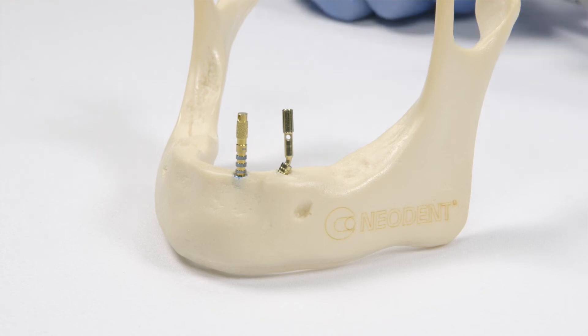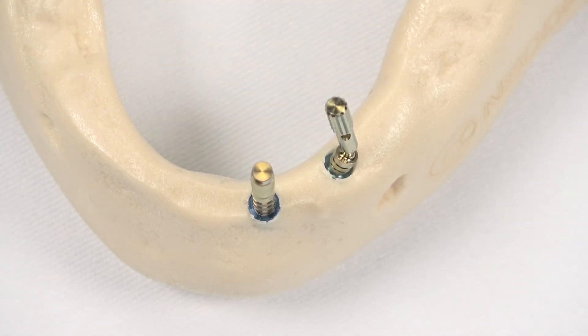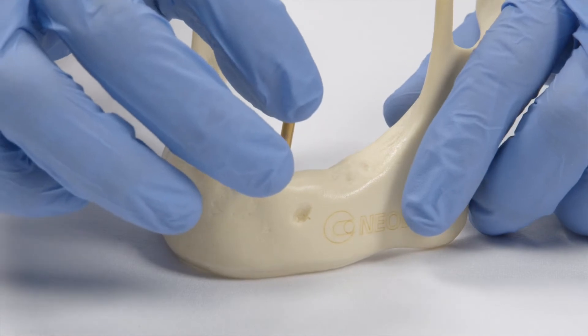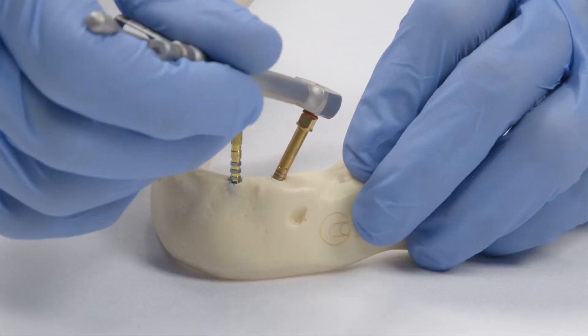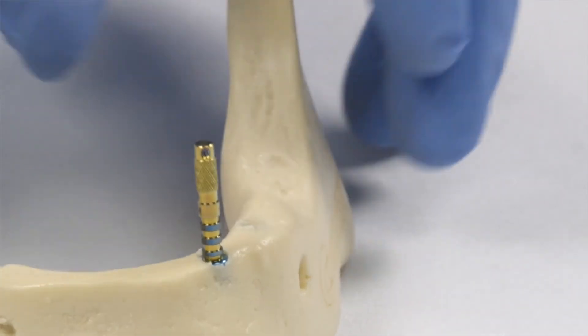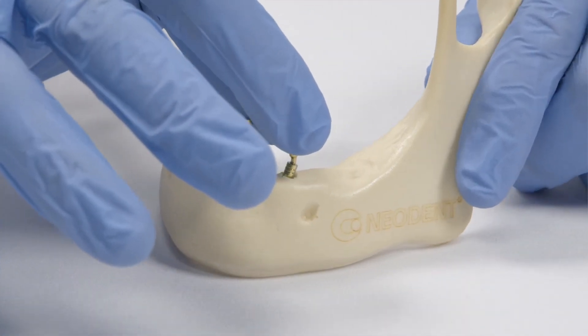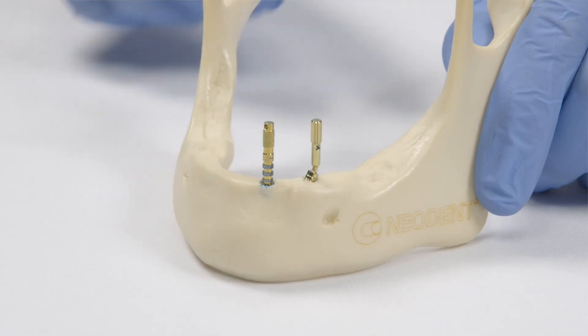When changing the position to another hex position, understand that they may be parallel from the front, but from the top the abutment isn't right. So the only way to fix that and have something in between is to re-engage the implant driver and with the torque wrench rotate that implant more forward. The goal now is to have the try-in abutment in a position where it's possible to see from the front and from the top — so now prosthetically they're very acceptable.